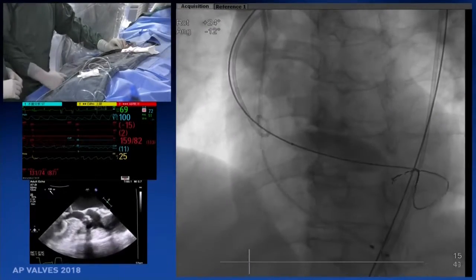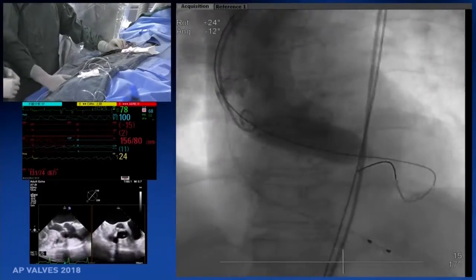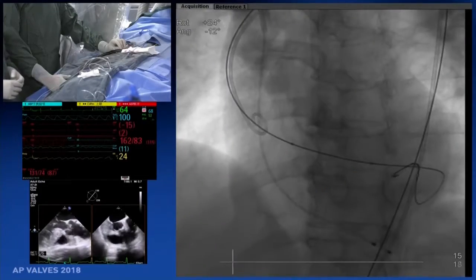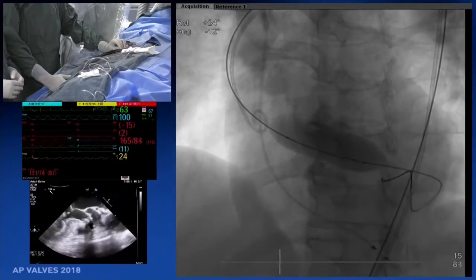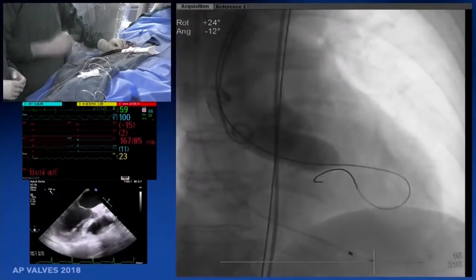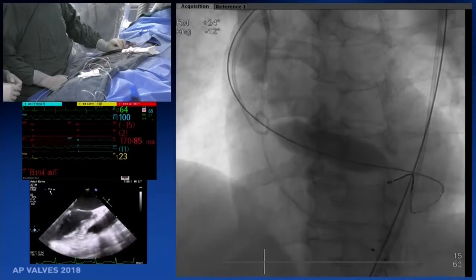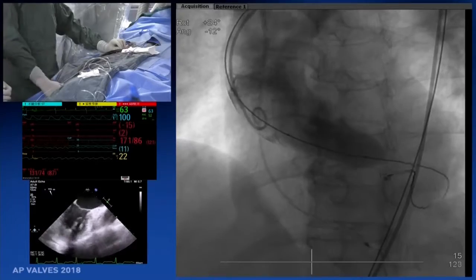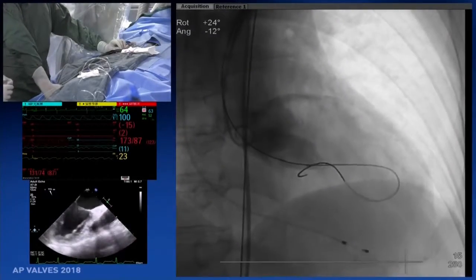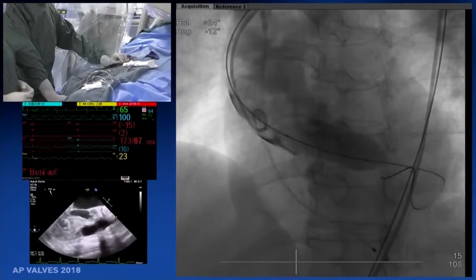So because we are worried about the... How about the size? So what is your suggestion? Which size do you prefer? You seal with a 20 millimeter balloon. So what is your choice for the valve now? 23? Yeah. 23. If the 20 is, yes, 26. I think the best selection is 23. 23. Okay. Very small. So we select the smallest one.